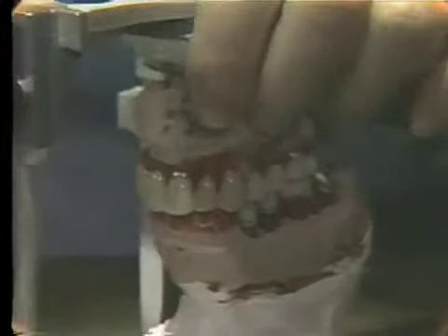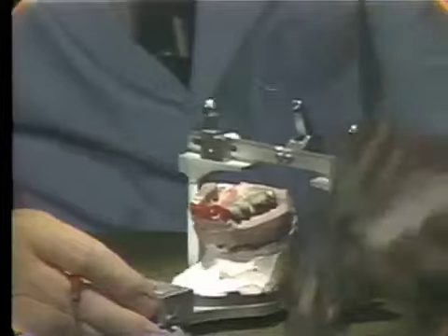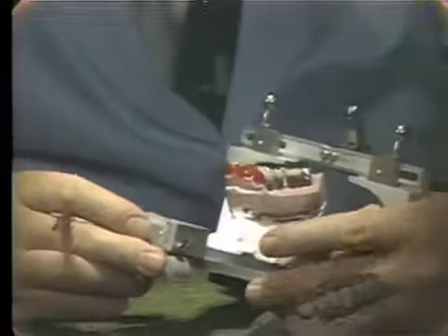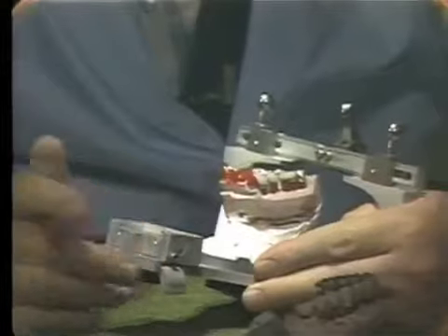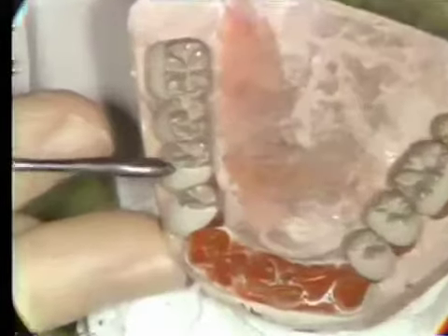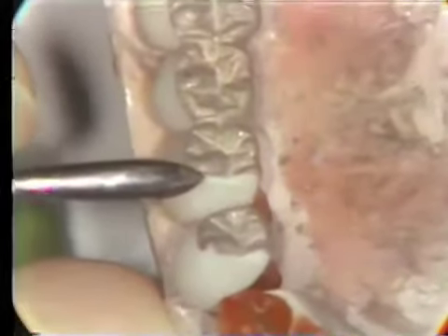The porcelain, placing the porcelain on the teeth, we've modified a little bit. This is a young girl, rather nice looking, and we've tried to camouflage the show of gold. So as you see here, there was no occlusal contact in the mesial pit area of the bicuspids, so we had the laboratory technician extend the porcelain into the mesial pit area.